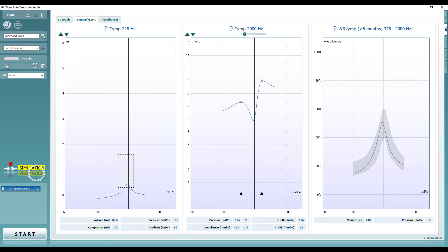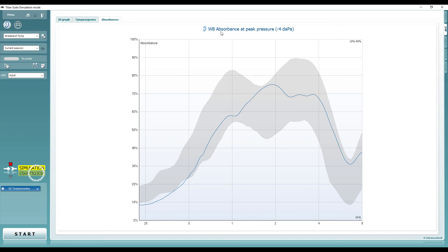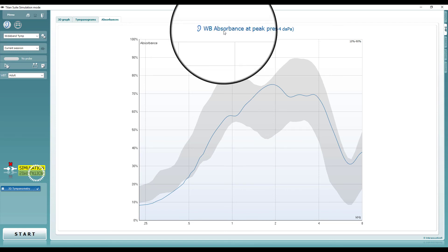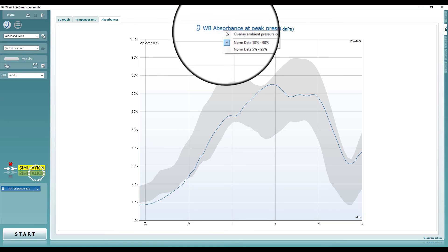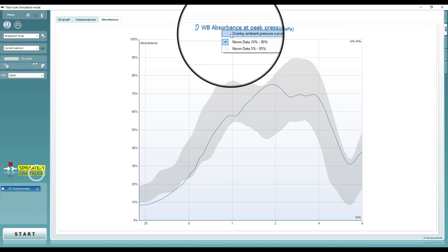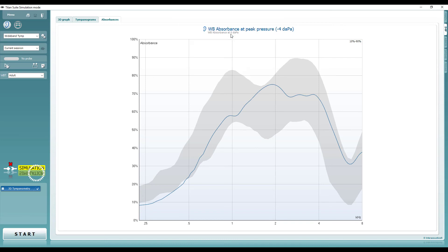The next tab displays the absorbances. The red or blue curve, depending on which ear is selected, displays the absorbance graph at peak pressure. It is possible to display the absorbance graph as recorded at ambient pressure, which is shown as a grey line.